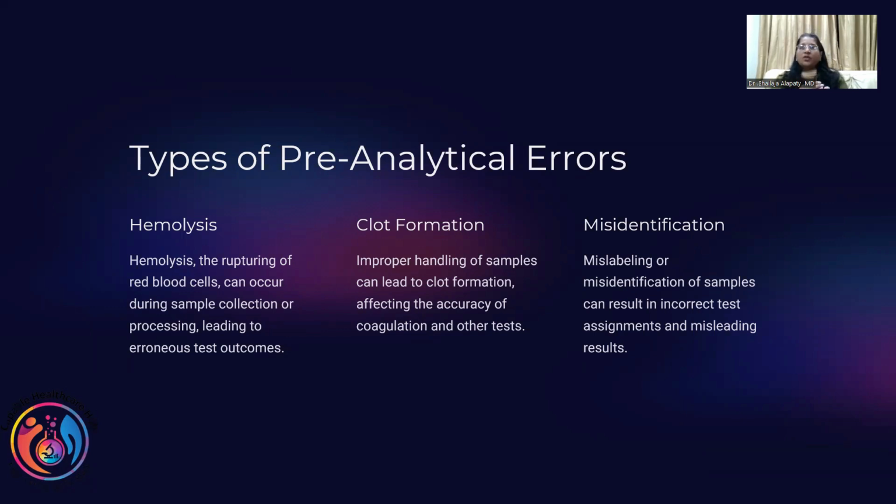So first and foremost, when the patient comes with the bill, we generate the label, stick it onto the Vacutainer and give that to the patient, and he goes there and they collect. We don't give the labels to the phlebotomist to stick on the tubes. At the registration counter, we stick the labels on the tube and give the tube to the patient, so that the patient has his own tubes with his own value. Got it? These are steps to mitigate errors.